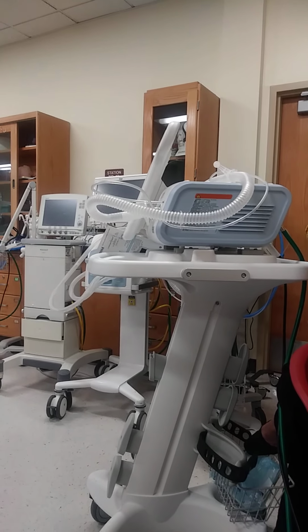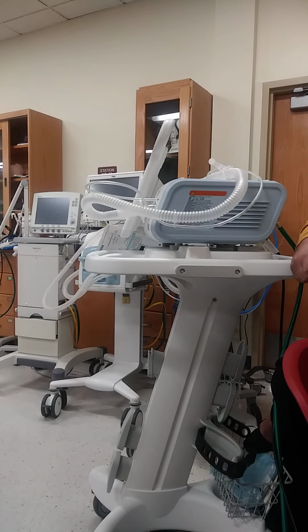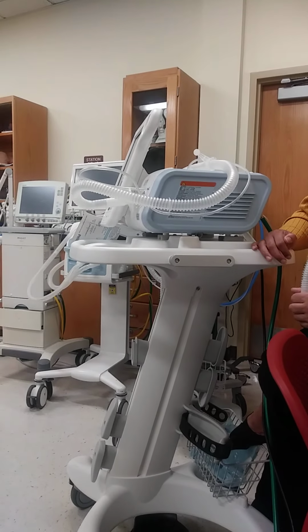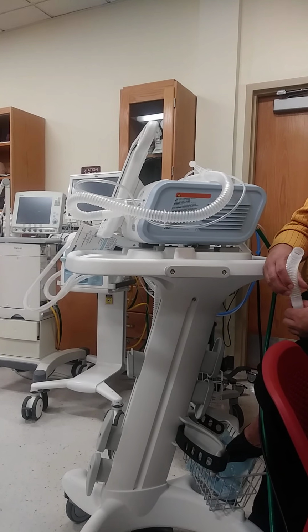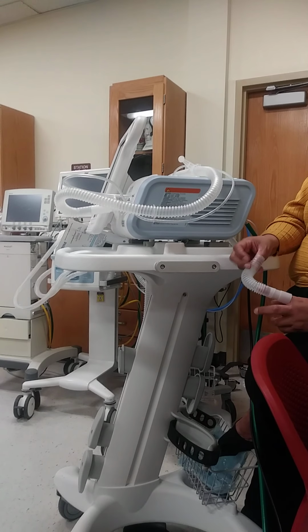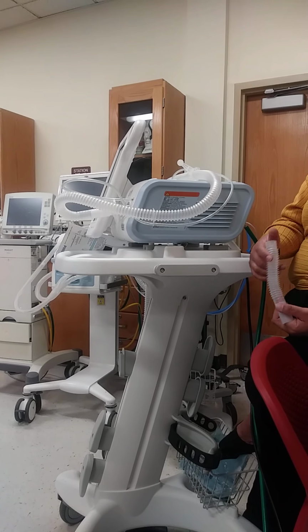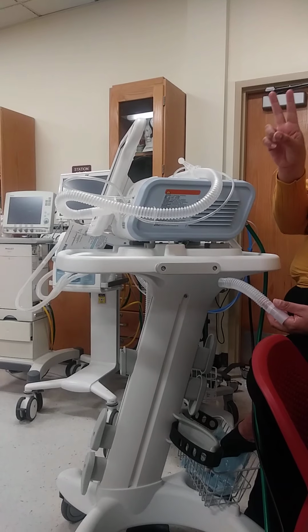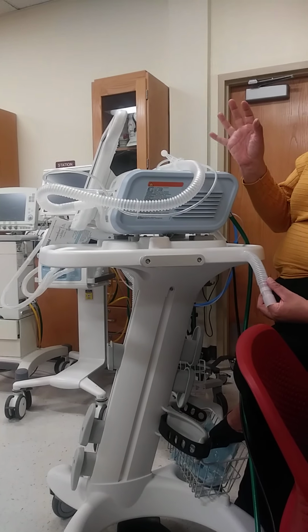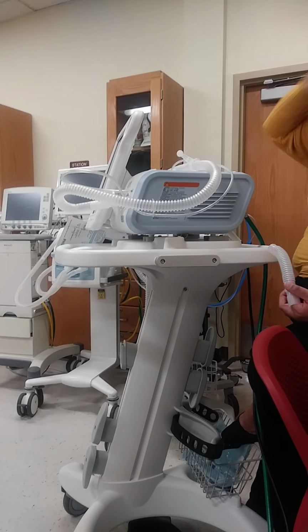So you said if they have sleep apnea, you can put them on. The way you have to think about it is CPAP is used for patients who have sleep apnea where they just have oxygenation problems. There are some people who have apnea where they run into oxygen problems and issues with retaining CO2. When they run into those two problems, then we use a BiPAP, because a BiPAP has more fine-tuned controls where I can set a volume and a rate. CPAP is just a pressure.